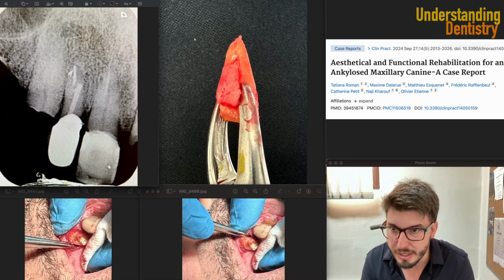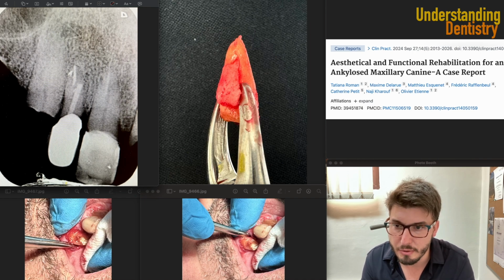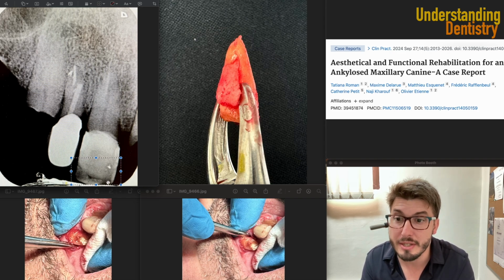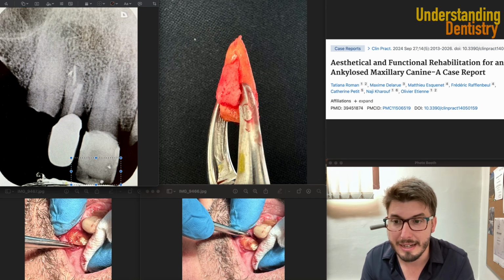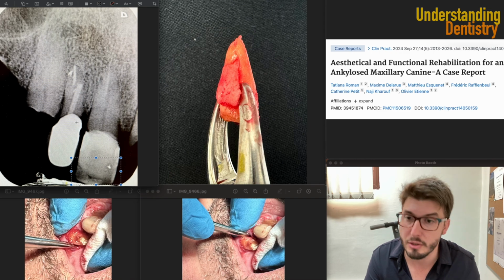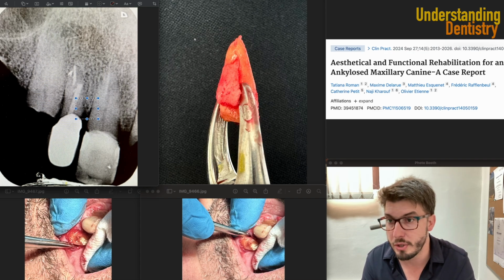We have a crown here with some overhangs, and then we have the overhangs of this crown here, and of course the fracture, or a crack. That's an image suggestive of a crack or fracture of the crown because there is an interruption of the continuation of this structure. So that's how we see the mesial overhang, and as a result we have horizontal bone loss.